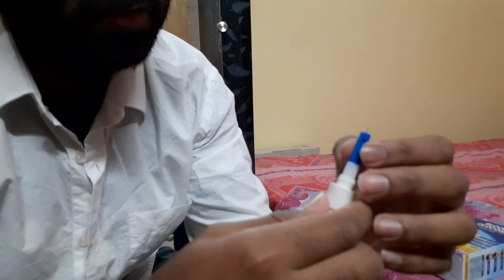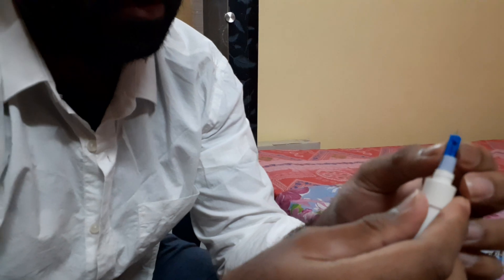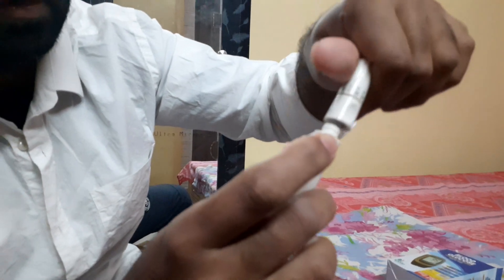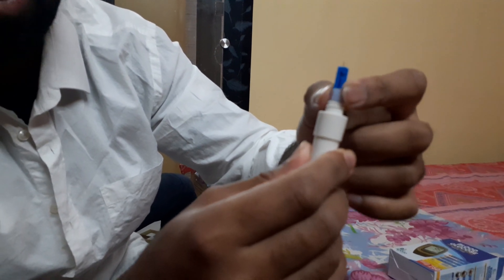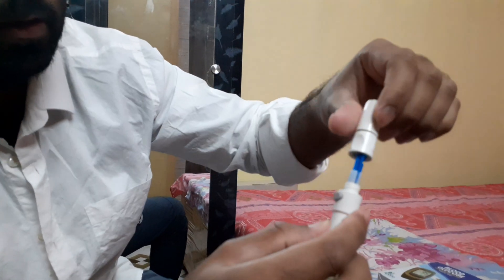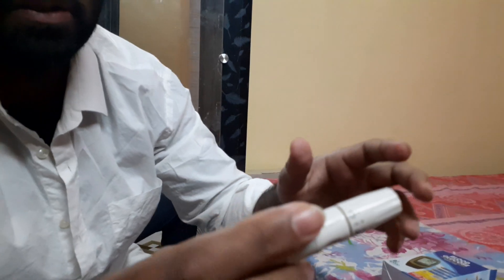This is how you insert the lancet — be careful that the pin does not pierce your fingers. Insert it in, and after that you insert its cap and press it so it locks up. Then you press the button to release it. You keep this on your finger — close it this way, keep your finger here, and press this button. It works just like a gun: when you press it, the needle comes out and pierces your finger to retrieve blood.